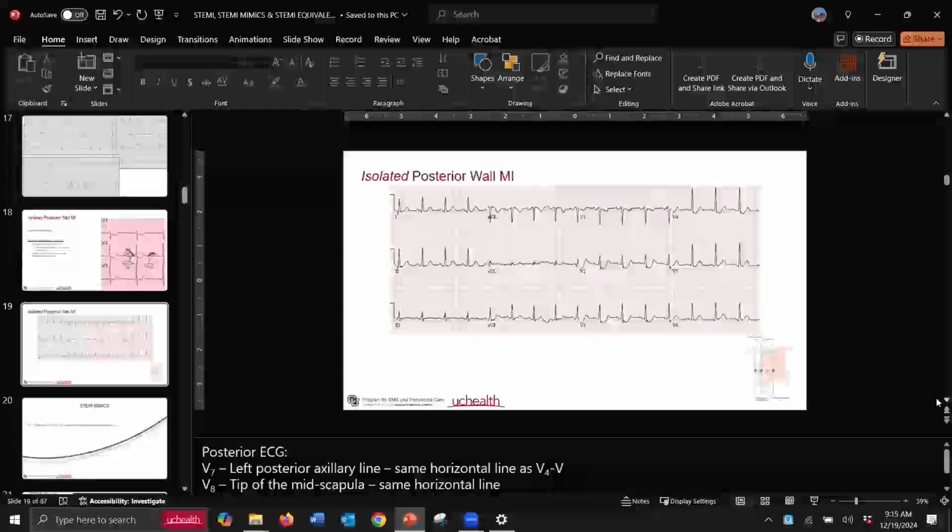Back in the day, Life Pack 9s, before they came out with this heavy duty 12 leads and transport cardiac monitors, the Life Pack 9, you used to be able to do modified chest leads. It's a 3 lead, and you take your left lower lead and put them on the precordial leads and turn it to lead 3. That gave you a modified chest lead, MCL 1, 2, 3, 4, 5, and 6.